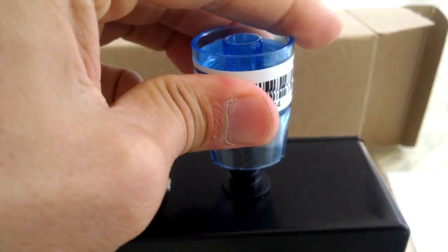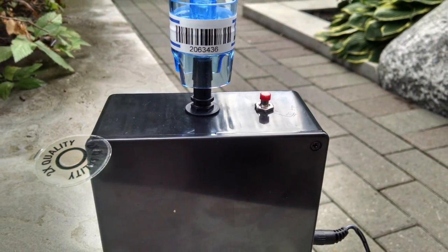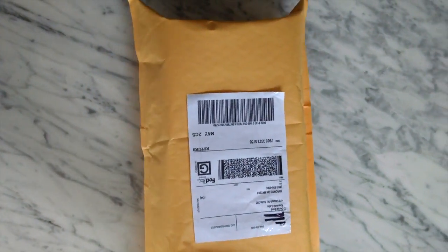Repeat this process for each room you want tested. Be sure to take one air sample outside for comparison purposes. When you're all finished, use the prepaid return envelope to mail the kit back to Absolute Labs.